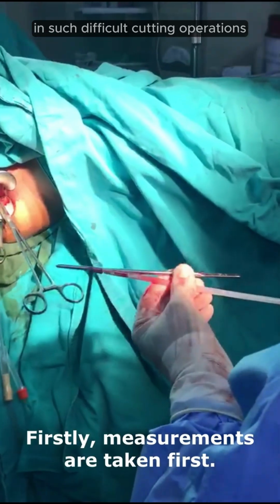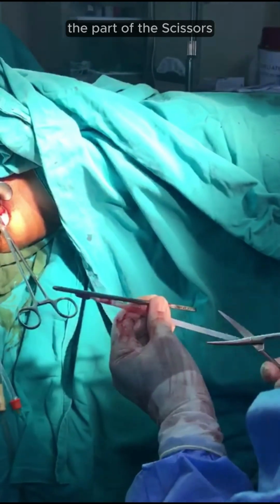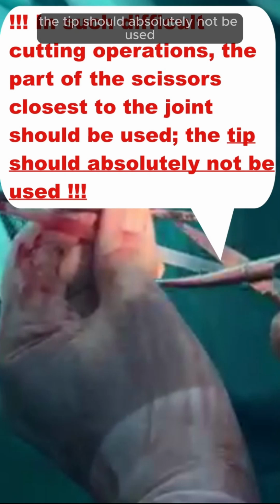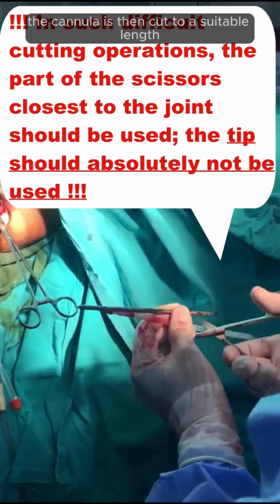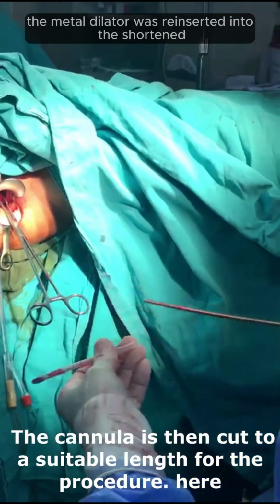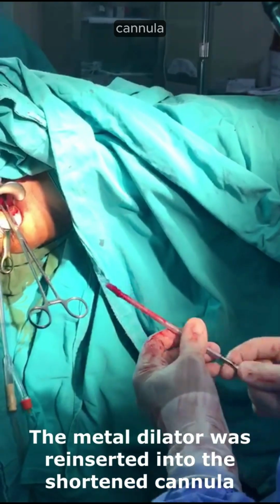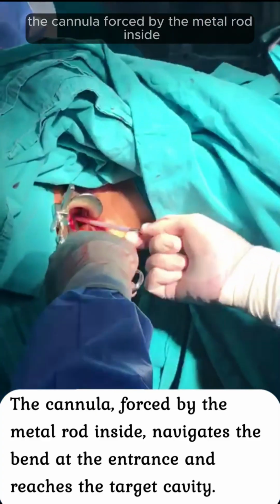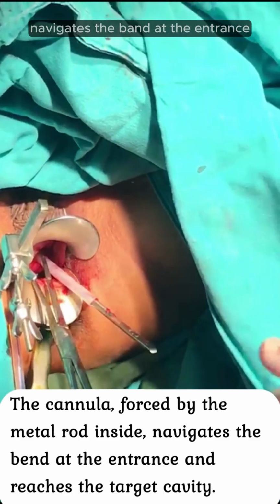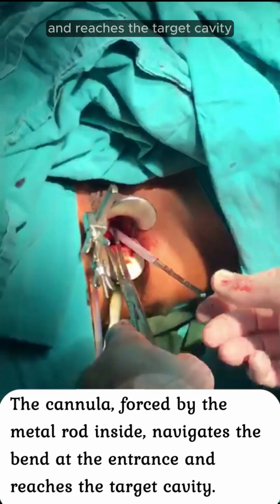In such difficult cutting operations, the part of the scissors closest to the joint should be used. The tip should absolutely not be used. The cannula is then cut to a suitable length for the procedure. The metal dilator was reinserted into the shortened cannula. The cannula, forced by the metal rod inside, navigates the bend at the entrance and reaches the target cavity.